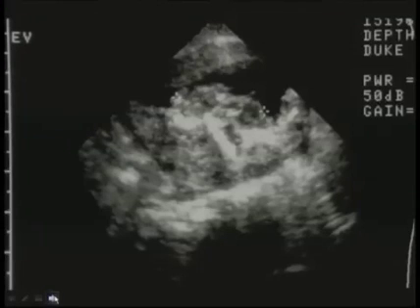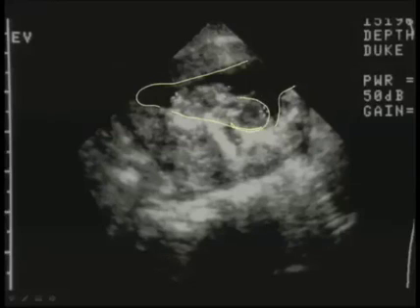Here's an example of embryonic death. You can see early on the gestational sac here is somewhat irregular. The embryonic pole demonstrated here has lost the normal segmentation. This is somewhat macerated. Usually by this time you can see the head clearly separate from the body, demonstrated here, and usually those are seen as two identifiable segments. Here they are somewhat amorphous.